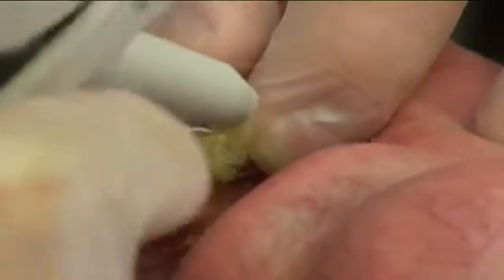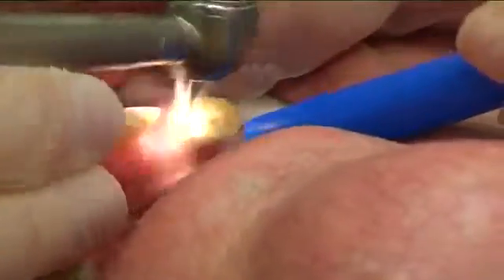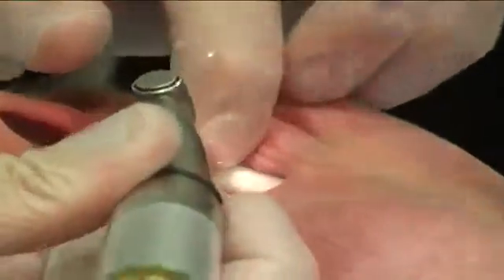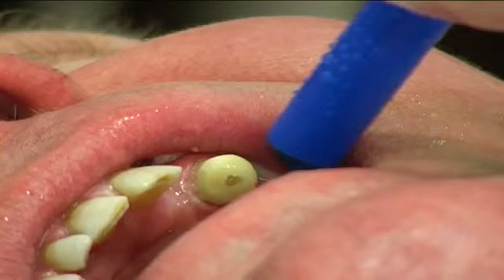The core was built up using composite core material and adjusted to the occlusion. Treatment will be continued in the next visit, so the core was adjusted to the occlusion.